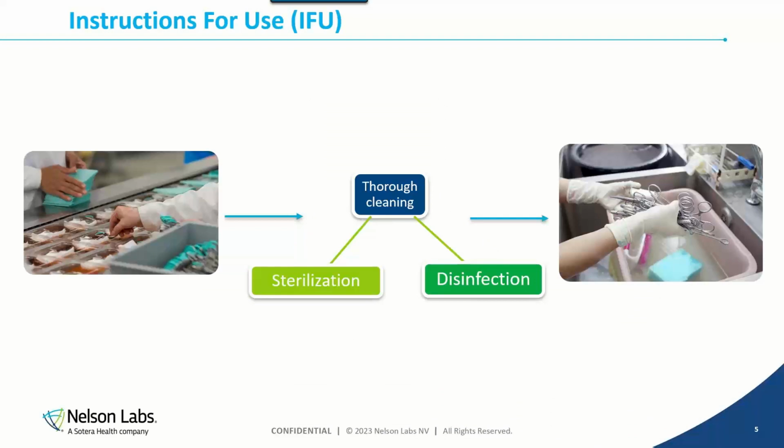Now, as a device manufacturer, it is your responsibility to tell people how they should process your device. So you have to design the IFU, outline the cleaning steps that have to be performed, or the disinfection or the sterilization steps, and really outline those instructions in your IFU. But of course, it is going to be the healthcare personnel that's actually going to do these instructions and perform these processing steps.